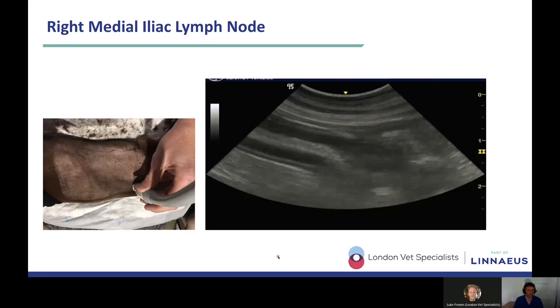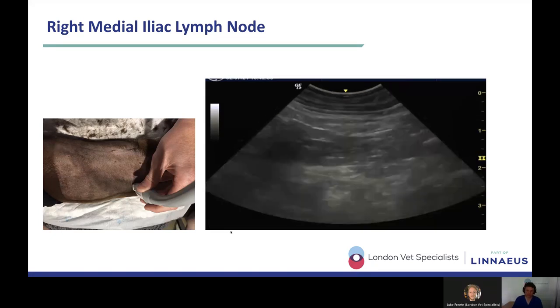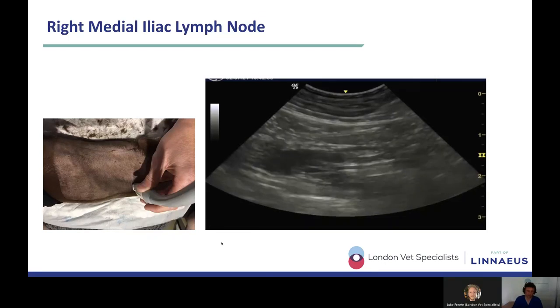And then we've got the right medial iliac lymph nodes. For this, we are finding the aorta again, finding the aortic bifurcation, but on the other side this time. So you're going to have to slide your probe caudally so that it's just cranial to the pelvic inlet. You're going to have to push on slightly just to find those greater vessels and tease them out. And then you're going to fan dorsally and ventrally, again, looking for kind of a sausage-shaped structure that is just adjacent to the aortic bifurcation, which in this dog is the structure here.